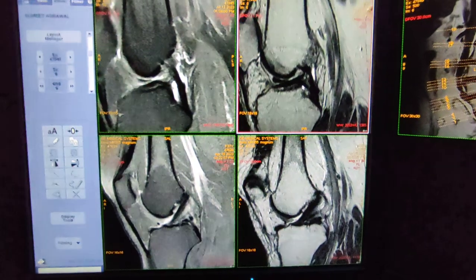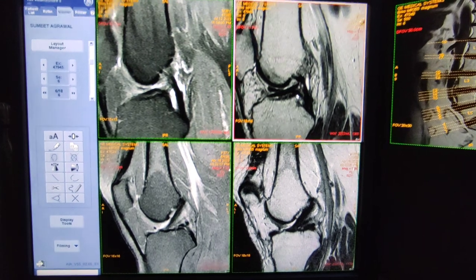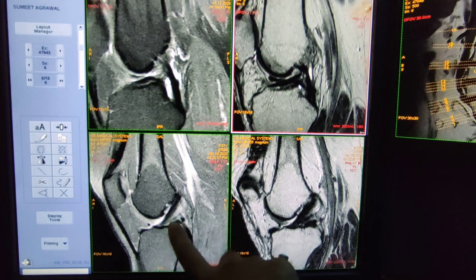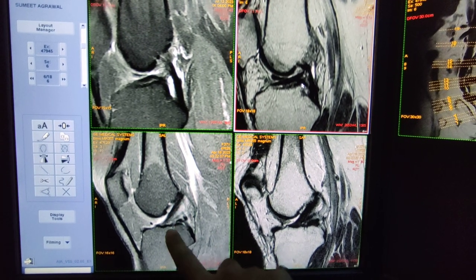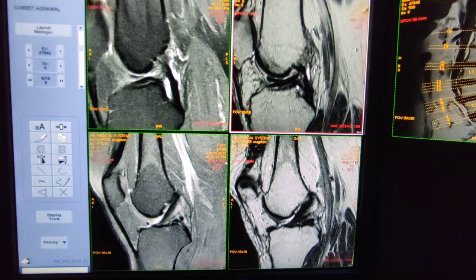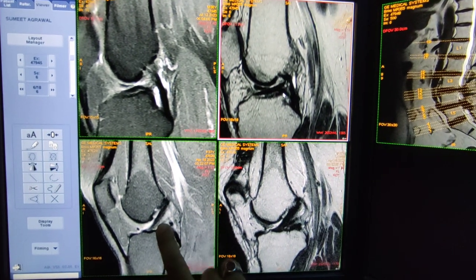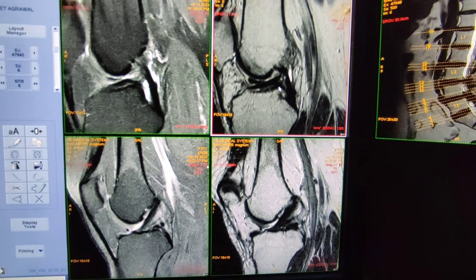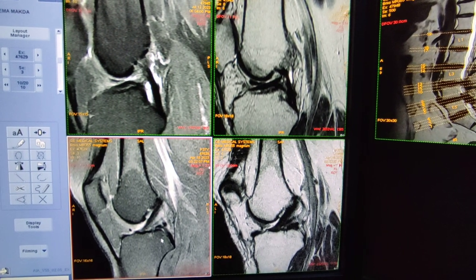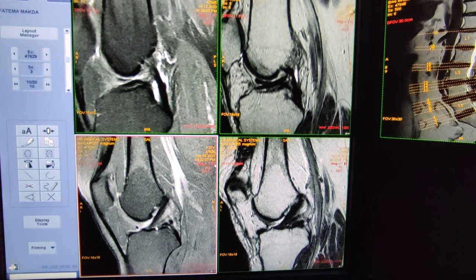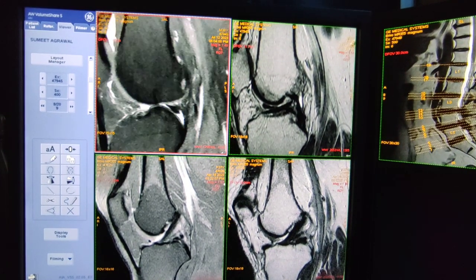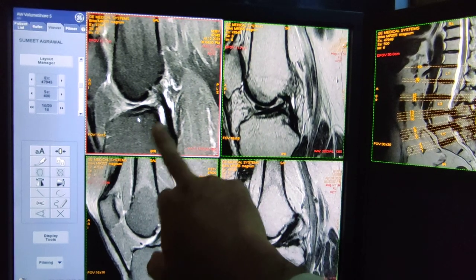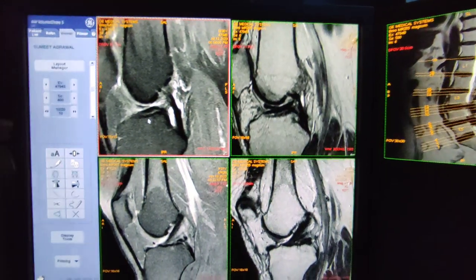In this type of scan, at your home also you can diagnose — you can see whether there is a signal in the ACL or not. You just have to see that the ACL should be dark in color. If there is some hyperintense signal, that may suggest a partial tear or a complete tear, or sometimes there are other conditions also in the ACL. When you see this type of feature — discontinuity of ACL at the femoral attachment — this may represent a complete tear of the ACL.